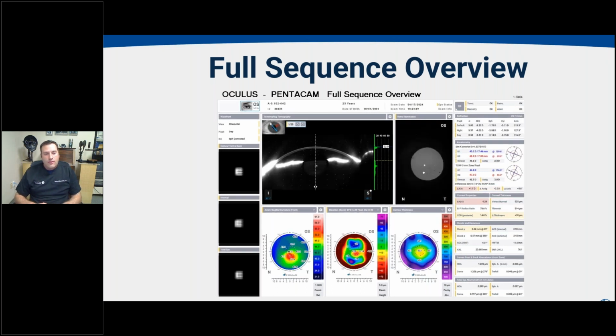Now, one word of caution with the AXL Wave, and this is something that is still being developed as we speak, as you move into more moderate and severe cases of ectasia in particular, where the posterior cornea is distorted, that can reflect itself somewhat on the internal aberration. So when we are dealing with more moderate and severe cases of keratoconus, as in this case, a more moderate case, the internal aberrations will reflect some of the posterior cornea. So this is, again, a 23-year-old patient with no internal lenticular aberration. But here you have to be careful about interpreting the simulation because this is still corneal aberration that is being displayed both internally and from the cornea as well. I know that the Oculus team is still working on this process, and hopefully with further development, as we get to our more moderate and severe cases, we're going to be able to really fully pull out the corneal aberrations from the visual system.